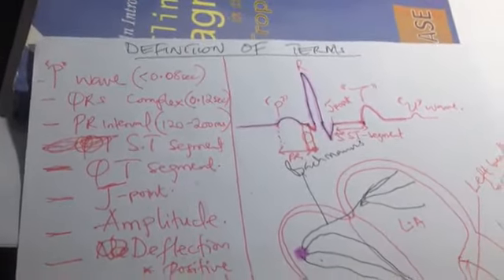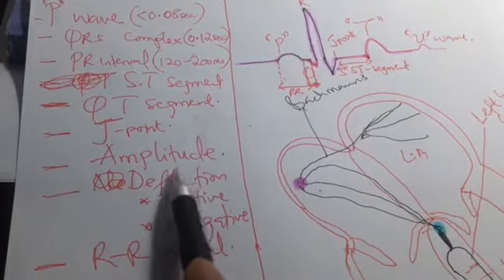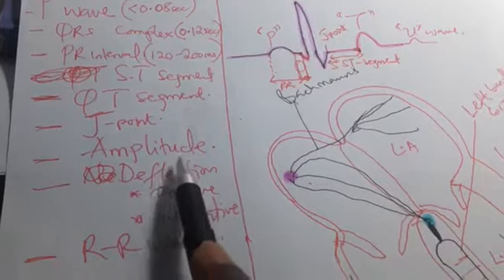Now we are going to see the amplitude. The better way to understand what amplitude is, is when we draw a graph like this. This is a graph. This is X and this is Y. When you are traveling in this direction, you are traveling in the X direction. When you are traveling in this direction, you are traveling in the Y direction.